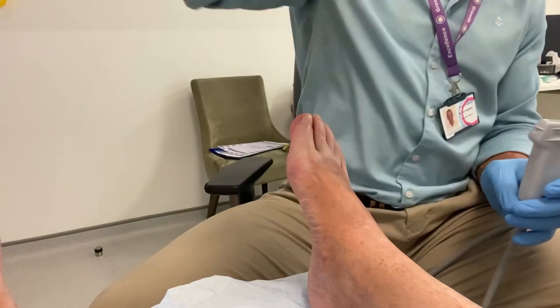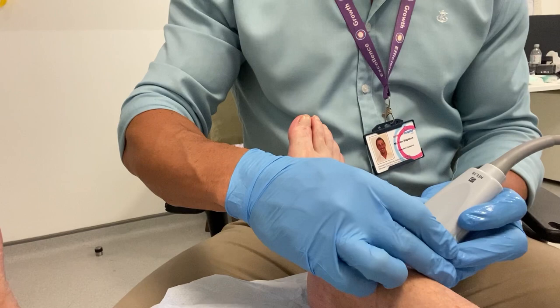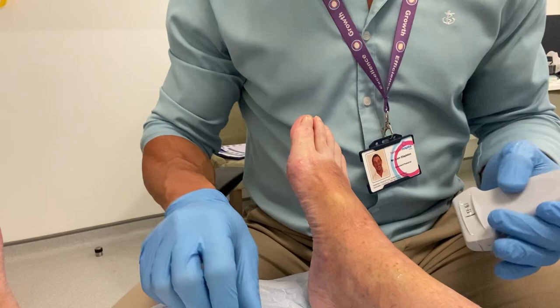Welcome to this video demonstrating ultrasound-guided injection of corticosteroid and hyaluronic acid for ankle and subtalar joint osteoarthritis. This patient had been suffering worsening pain for at least a couple of years.